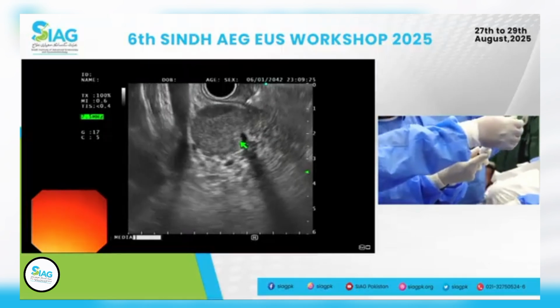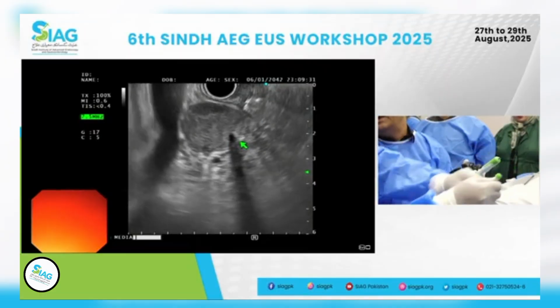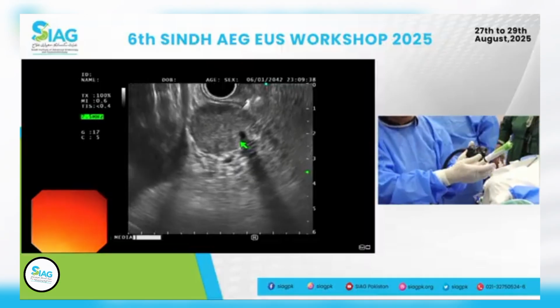What? Yes, the stylus needs to be removed. Take it out now. So you see the needle right there. Hold this. And it's okay to ask your tech to hold it for you. You really need to hold it.